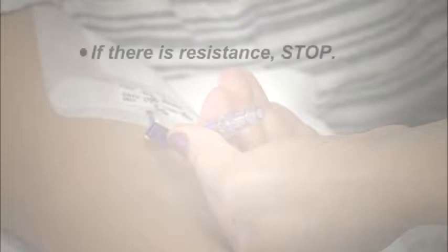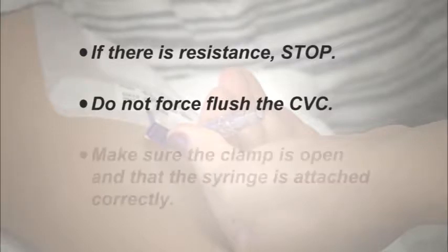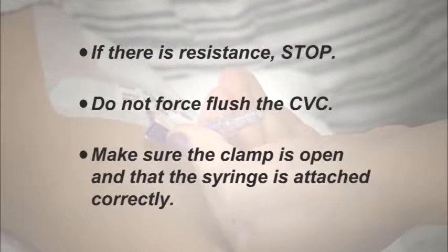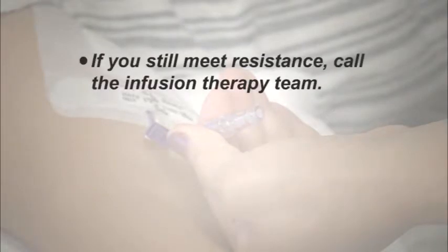During the flush, if there is resistance, stop. Do not force flush the CVC because you could damage and rupture the catheter. Instead, check to make sure the clamp is open and that the syringe is attached correctly. If you still meet resistance, call the infusion therapy team. The catheter may have built up a blockage.